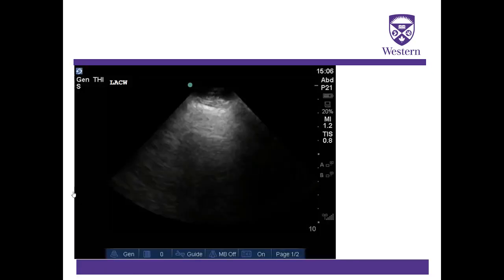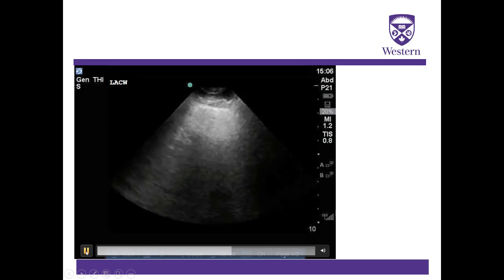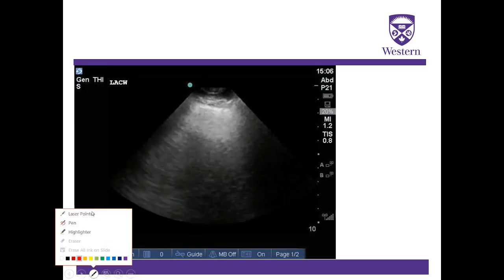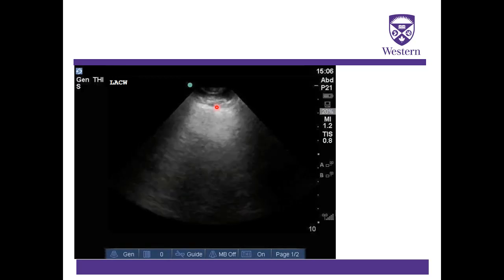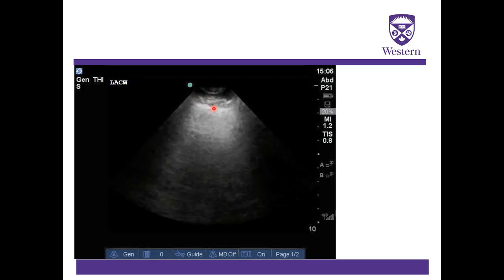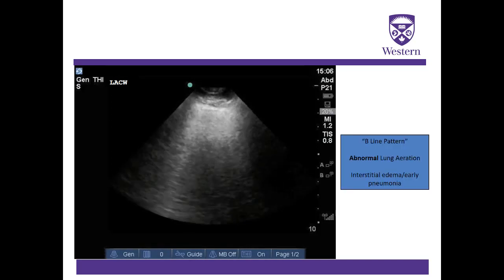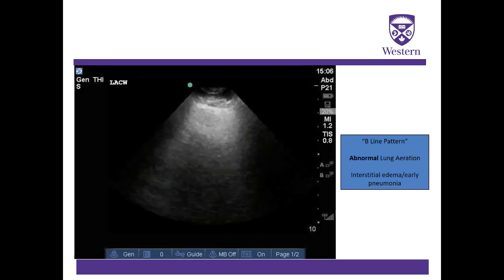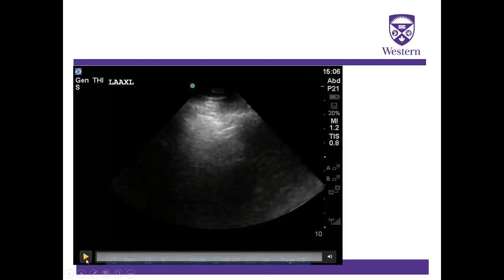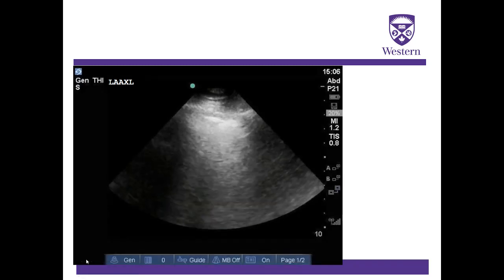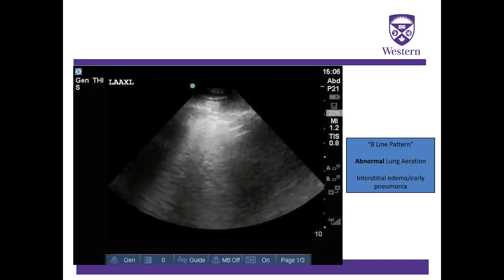Starting with the left lung, our first image is taken in the left anterior clavicular line. There is sliding of the pleural line, ruling out pneumothorax at that point, and B-lines throughout, emanating from the pleural line all the way to the bottom of the image. We interpret this scanning point as a B-line pattern suggesting abnormal lung aeration, which could represent interstitial edema or early pneumonia. The left anterior axillary line shows pretty much the same findings, so our interpretation at this left lung scanning point does not change.